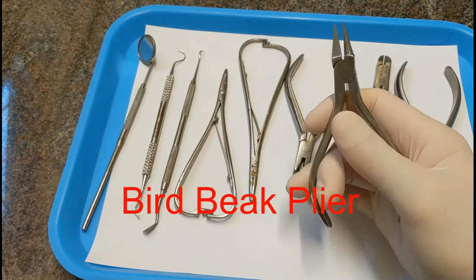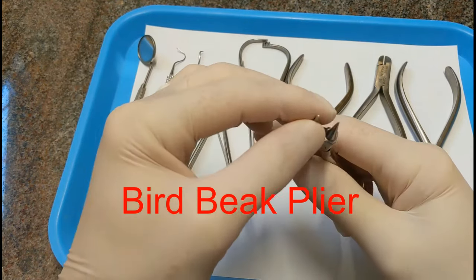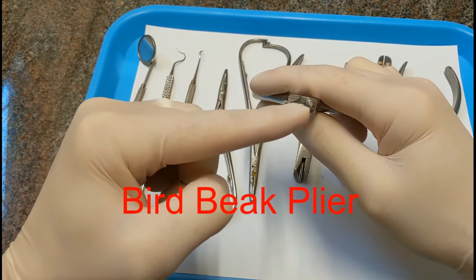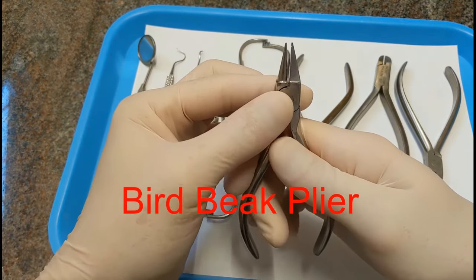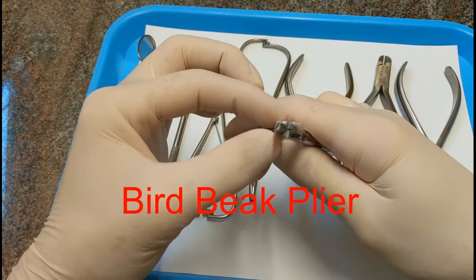This is called a bird beak plier. One side is a square pyramid and the other side is a cone — that's what a bird beak plier looks like. This is for putting bends in a metal arch wire.